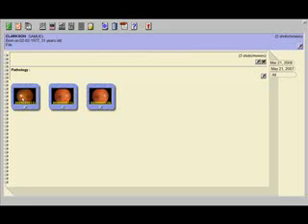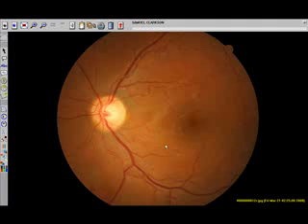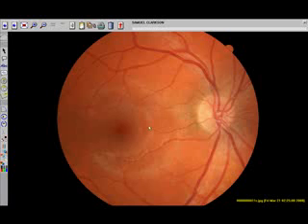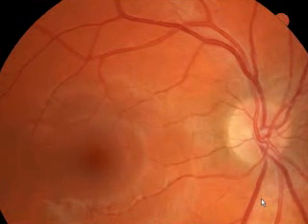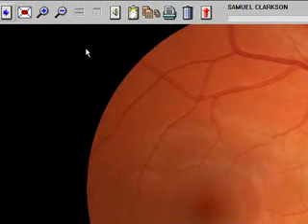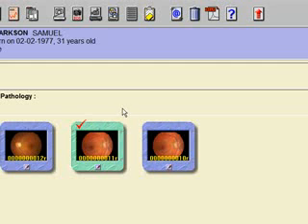To review the photos, click on the picture in the center of the thumbnail. To advance the photos, click on the arrows in the upper left-hand corner. To zoom the image, scroll your mouse wheel. To exit, press the red arrow at the top of the screen.